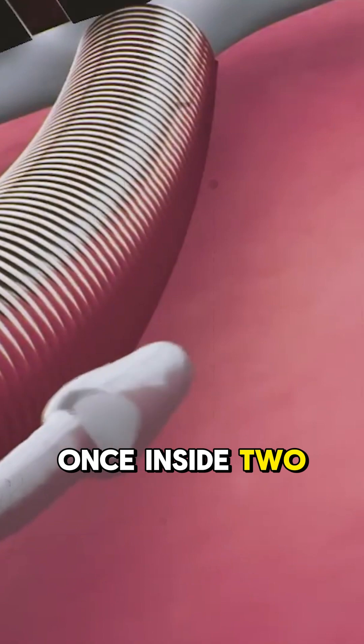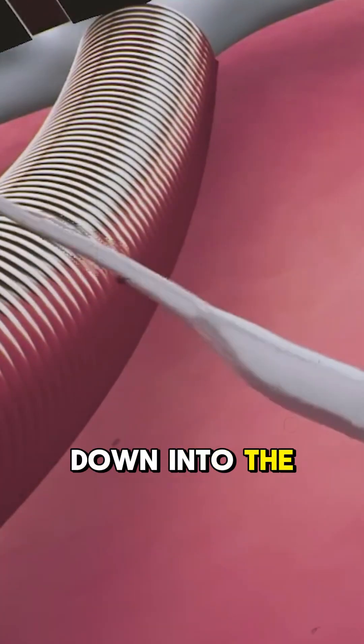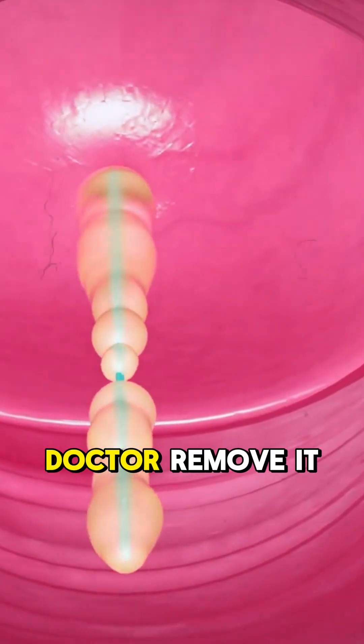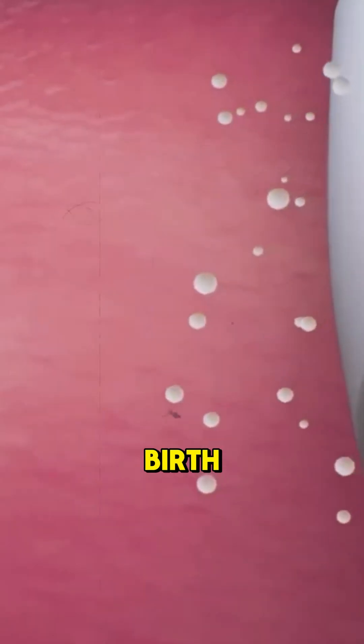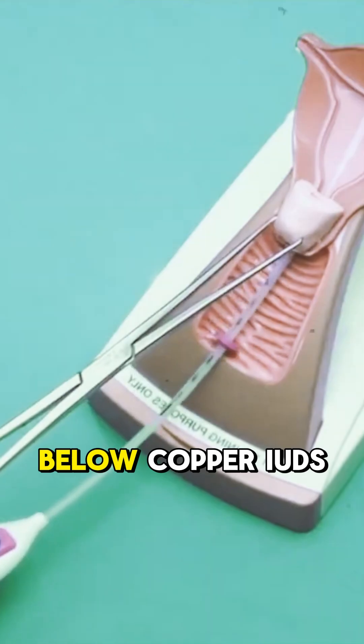Once inside, two small strings hang down into the cervix. These help the doctor remove it later when needed. Would you consider using an IUD for long-term birth control? Let me know below.